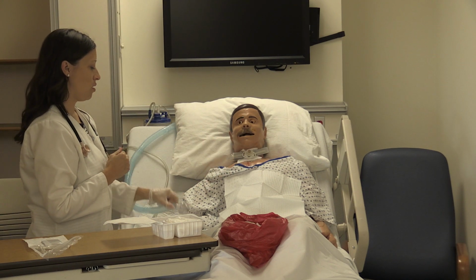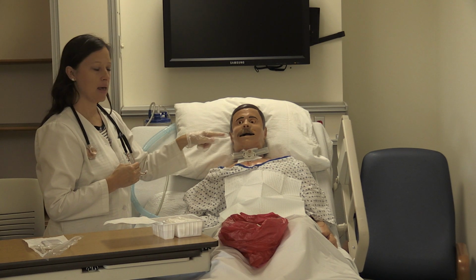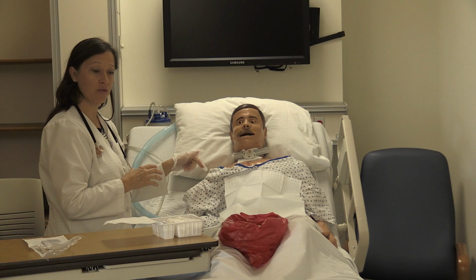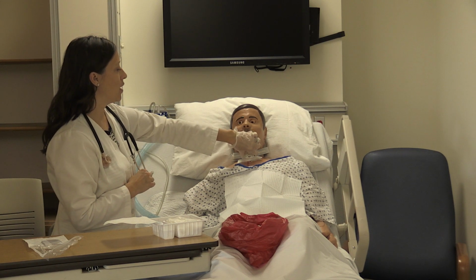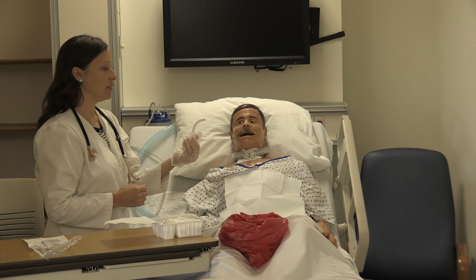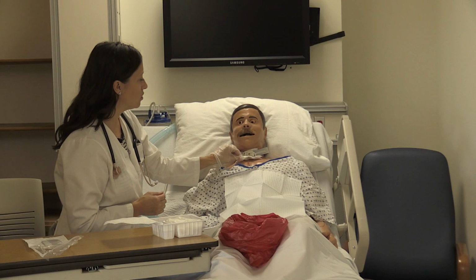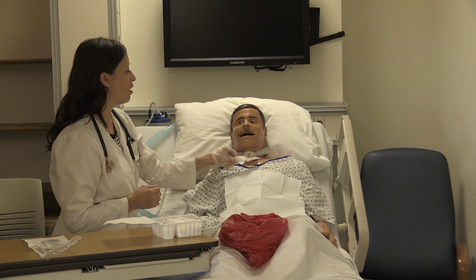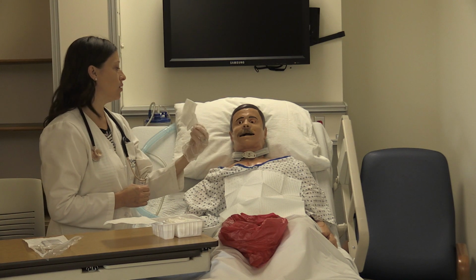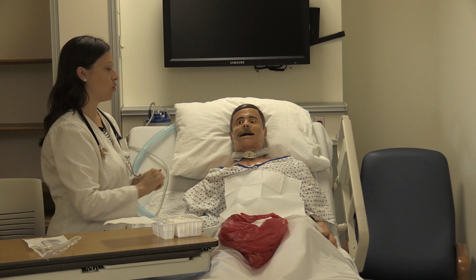And I'm also now, there's two things I need to do. I need to take out my inner cannula, and I need to take out my sterile dressing here, the old one, and reapply both new ones. So I'm going to go ahead and take the inner cannula out, and I'm going to inspect it, inspect the cuff tip, looks good. And then I'm going to go ahead and take this 4x4 dressing off, and I'm going to look at any secretions or any drainage on the dressing area. And then it's skin to skin to remove that.